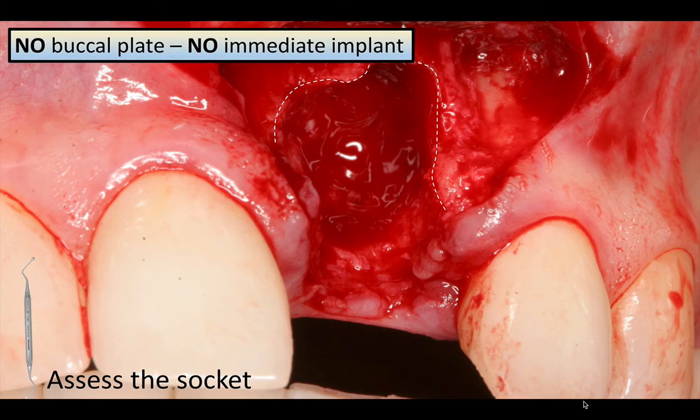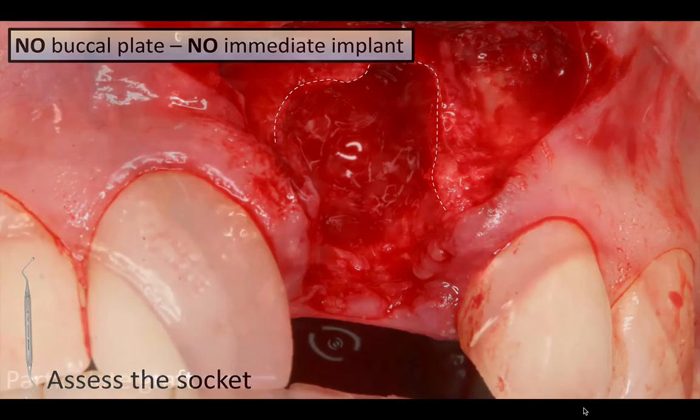In my opinion, it's too risky, and my preference is to rebuild the site with bone and sometimes with soft tissue, get as ideal as I can, and only then place an implant and not worry about initial stability and having some compromise to the final result. So that's my opinion. That does not mean that an immediate implant cannot be done and it's not going to work, but I think there's an element of risk that in these situations I don't like to take.